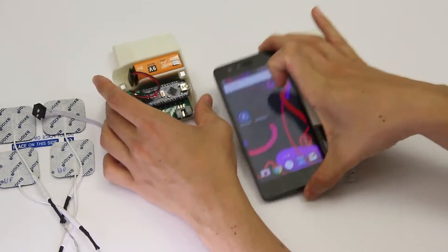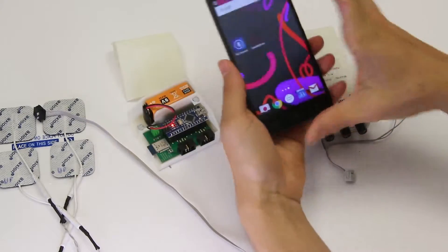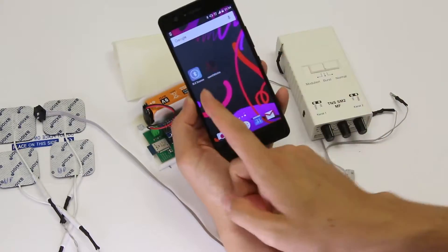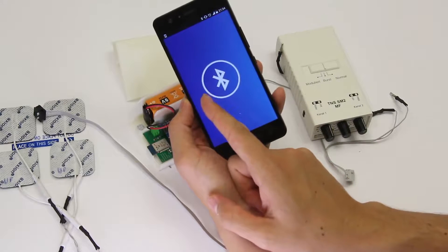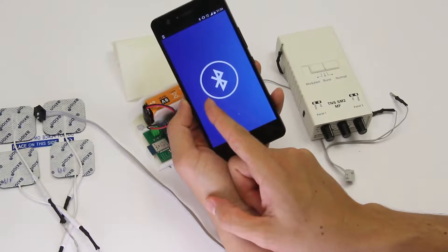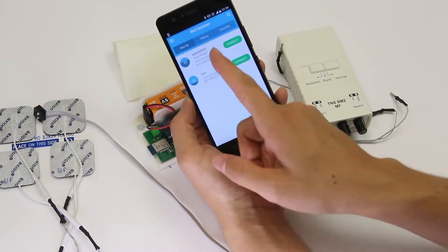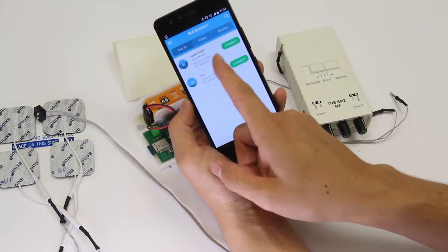I'm here on my Android phone starting an app called BLE Scanner, Bluetooth Low Energy Scanner. This is something that I got from the Google Play Store.